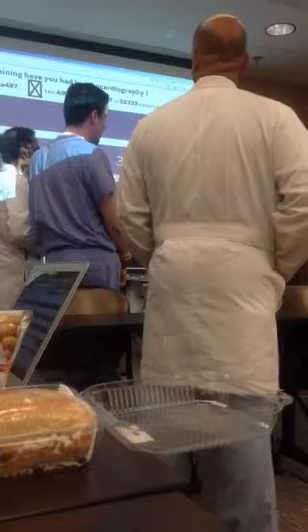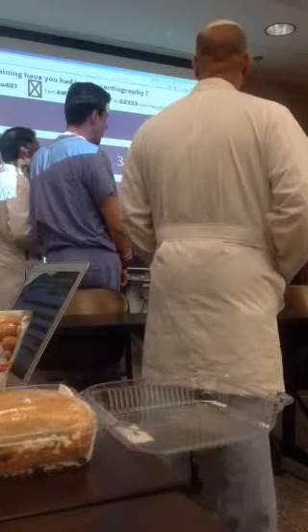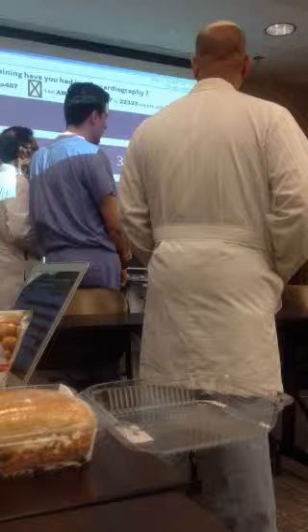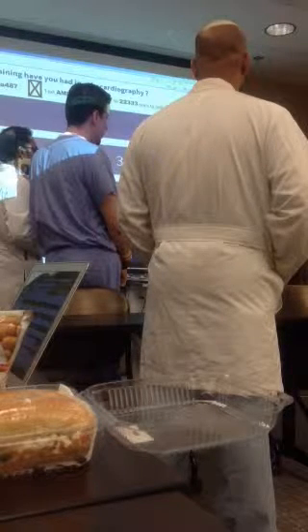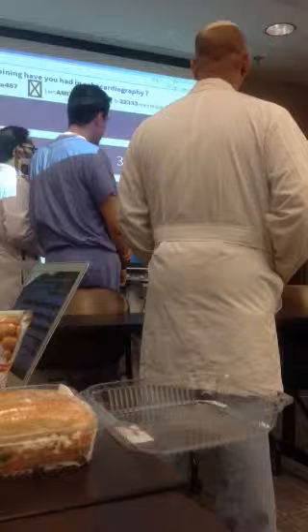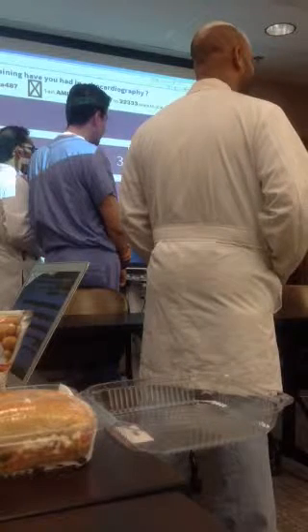them up. These are labeled with RA for right arm, LA for left arm, and LL for left leg, which you usually put right here underneath the left side, or wherever you can find a spot.